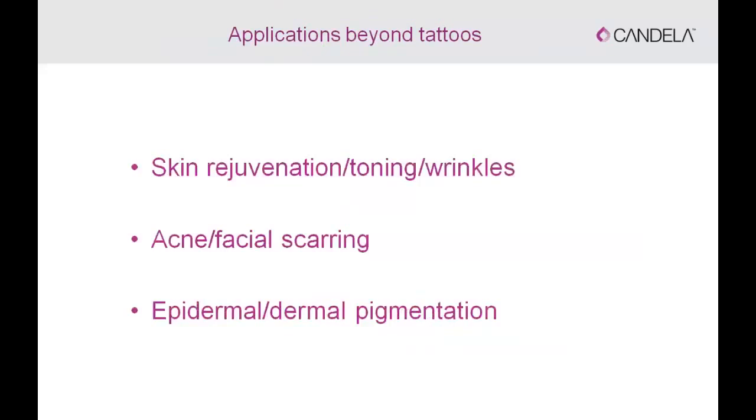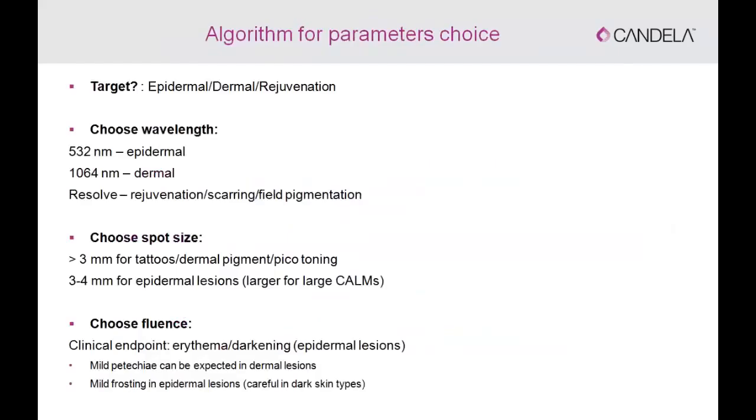So, can we use the PicoWay outside of tattoos, beyond tattoos? Absolutely, as I mentioned and published already on this. It can be used for skin rejuvenation or toning, fine lines and wrinkles, scarring, and of course for epidermal and dermal pigmentation.